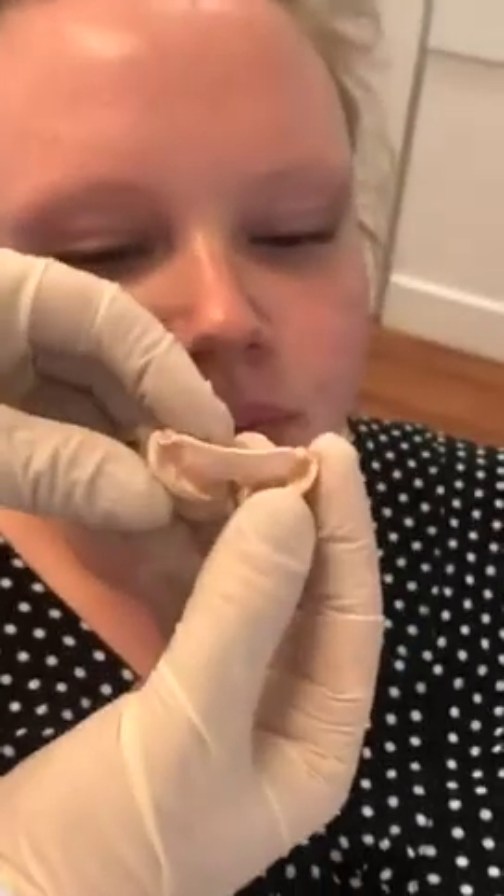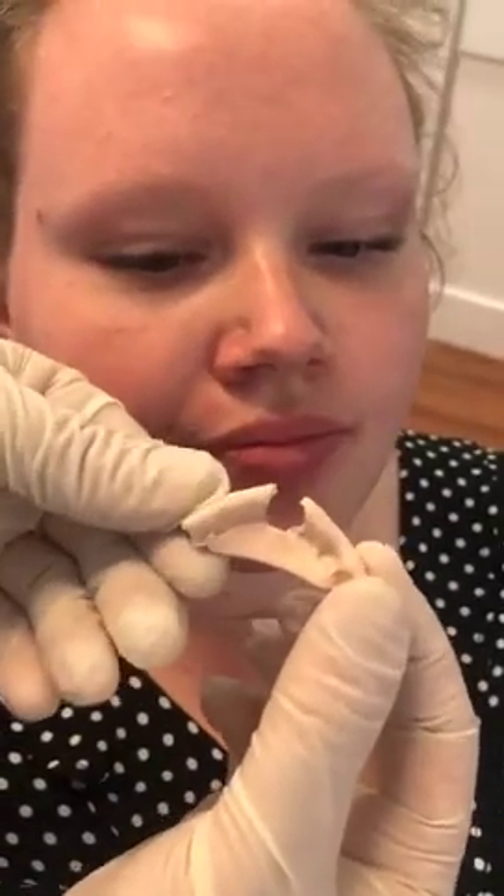Slide your jaw a little bit further forward and bite down. Now the patient is biting back into it — open again, bite a little bit further forward. At that point the patient would realise that they're not biting directly into the appliance. I would have a mirror here so the patient is aware of where natural feels, then open and bite back into the indentations. As we take the device out, you would then show the patient the exact indentations and how to use it.